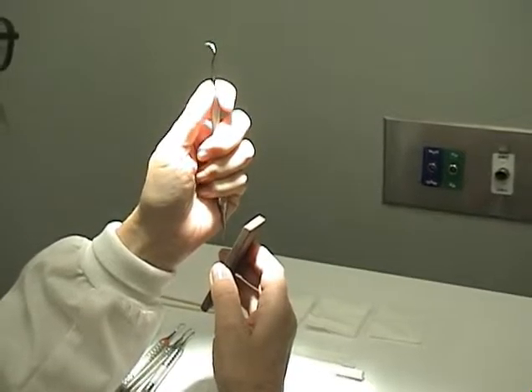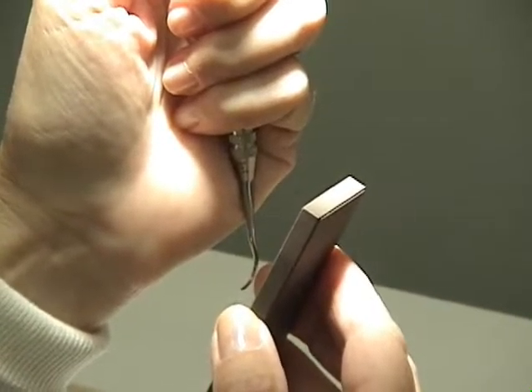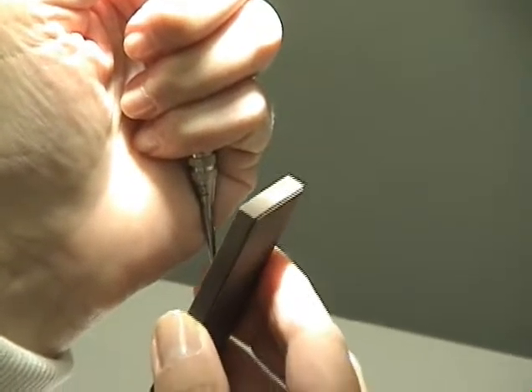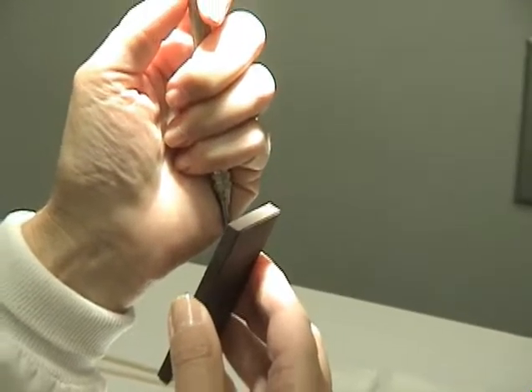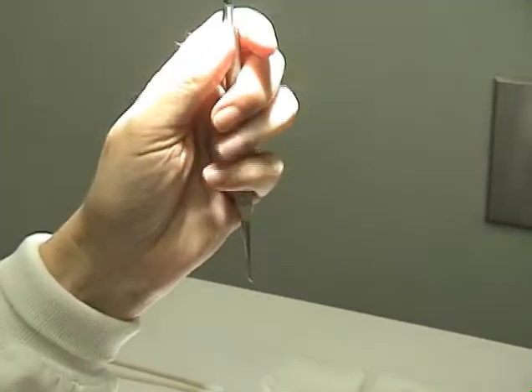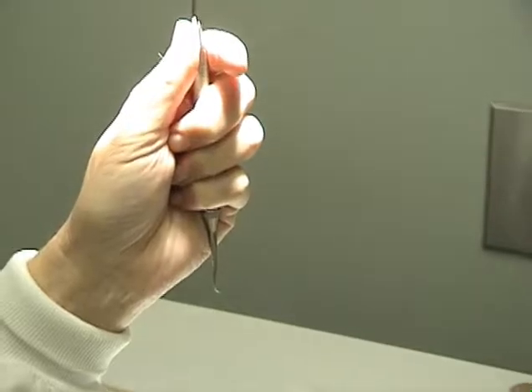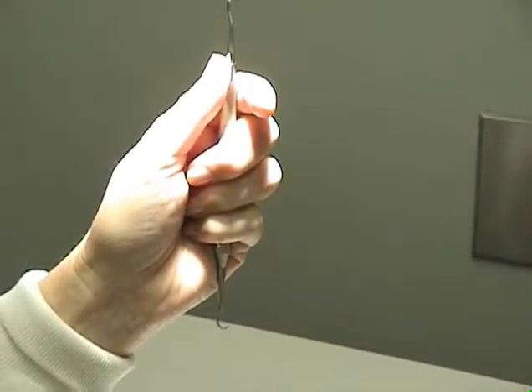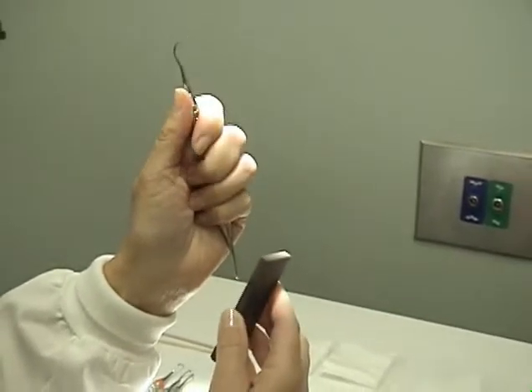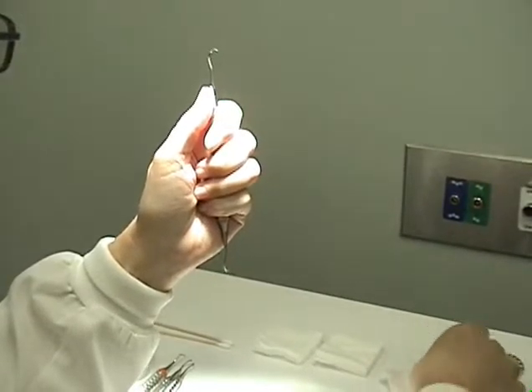The first instrument we will demonstrate is the sickle scaler. Hold the instrument with the terminal shank at 12 o'clock and the tip towards you at six o'clock. The stone position will be one o'clock. With an up and down movement, sharpen your blade starting with the heel third, the middle third, and then the anterior third. Then rotate the instrument the opposite direction and repeat: heel third, middle third, anterior third.